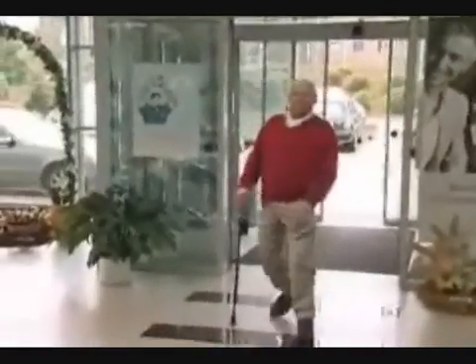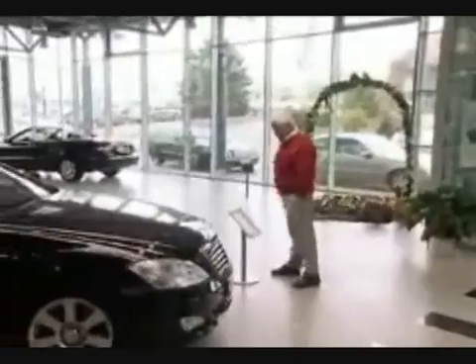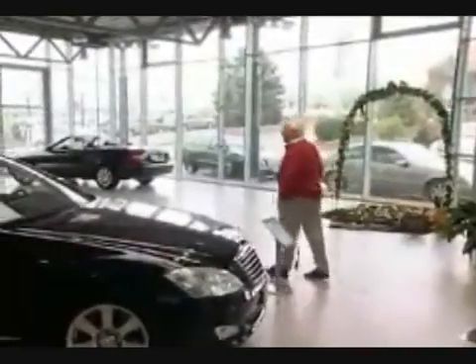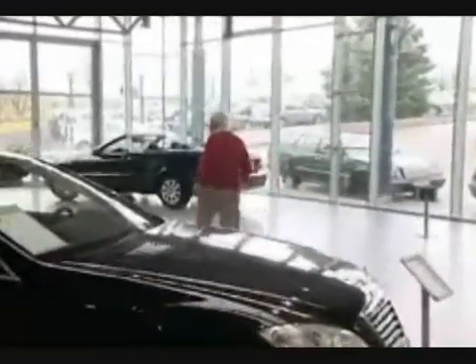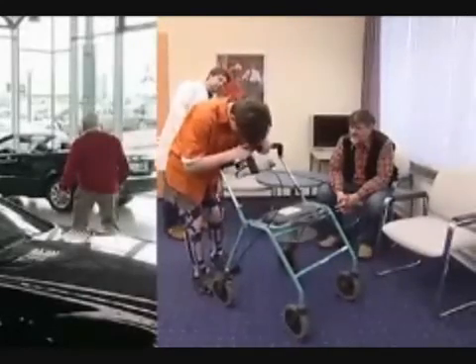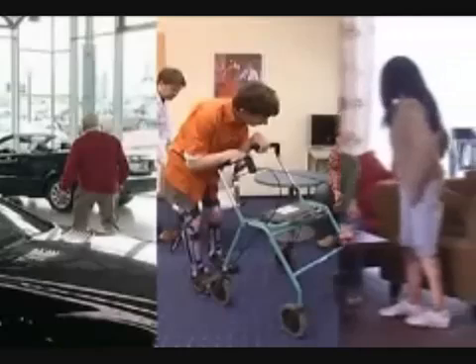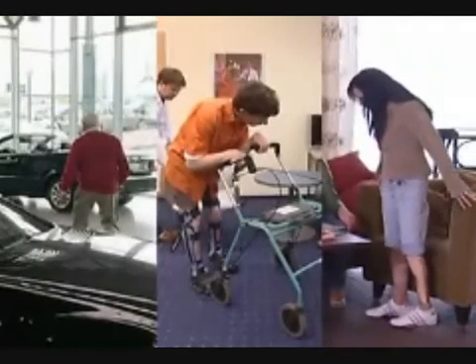The E-MAG control joint system improves the quality of life of people for whom free motion knee joints and swing phases are no longer an option, or who can use these appliances only to a limited extent. This may be due to diverse reasons, such as poor muscular status, long-term adaptation to rigid devices, or multiple problems. This situation is most commonly caused by poliomyelitis, post-polio syndrome, and paraplegia.